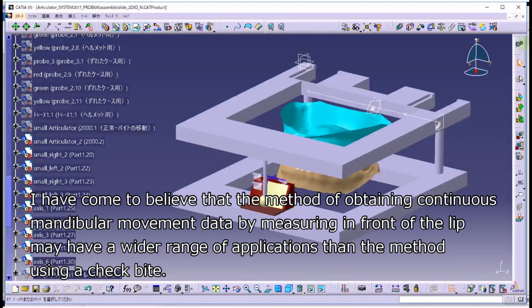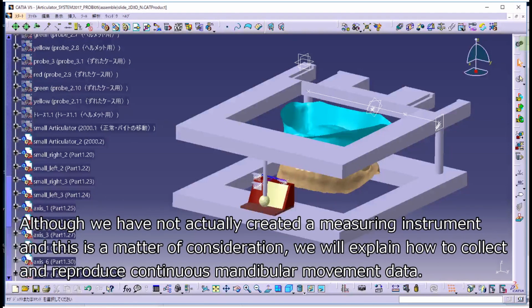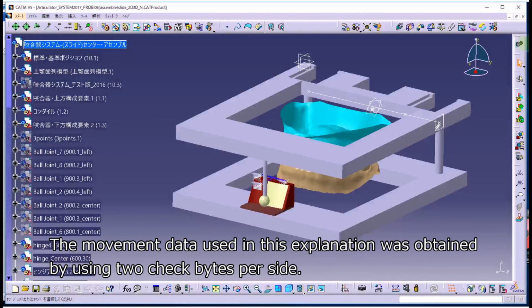I have come to believe that the method of obtaining continuous mandibular movement data by measuring in front of the lip may have a wider range of applications than the method using a check bite. Although we have not actually created a measuring instrument and this is a matter of consideration, we will explain how to collect and reproduce continuous mandibular movement data. The movement data used in this explanation was obtained by using 2 check bites per side.